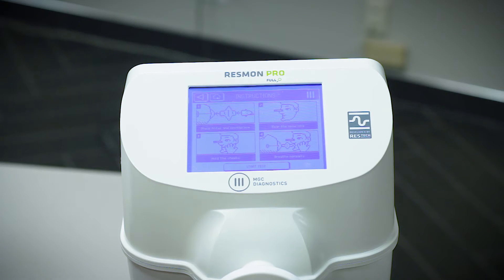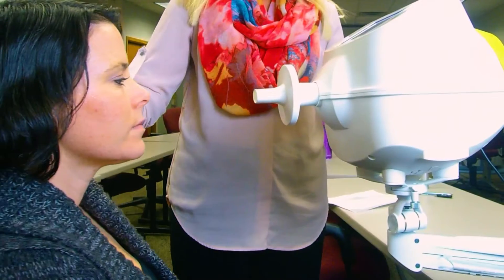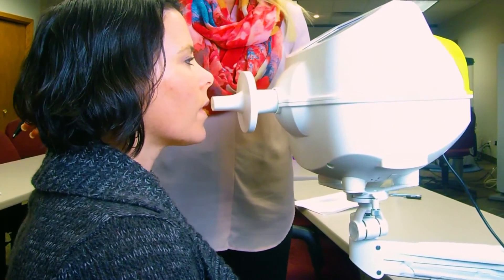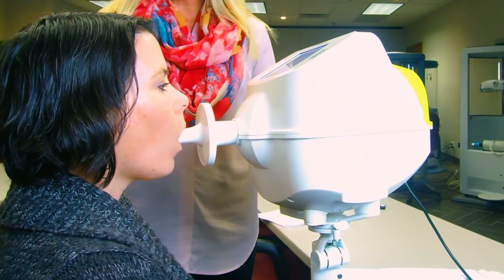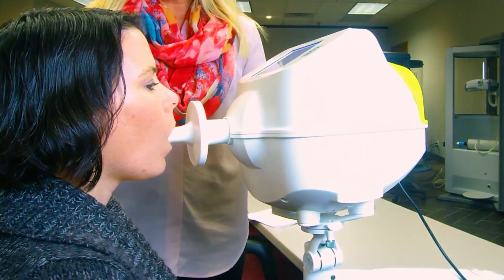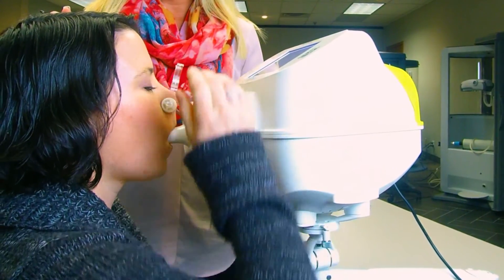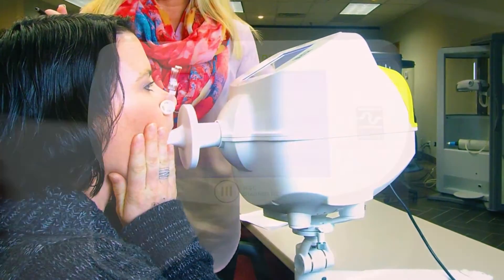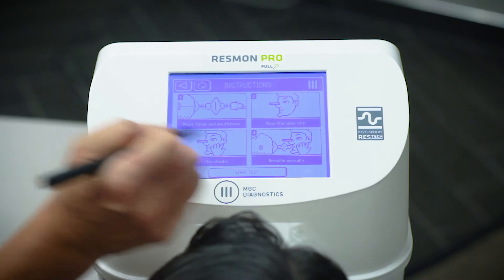We position our patient onto the mouthpiece, with the neck at about a 90 degree angle, not under nor overstretched. Nose clip on and hands on the cheeks. We then select Start Test.